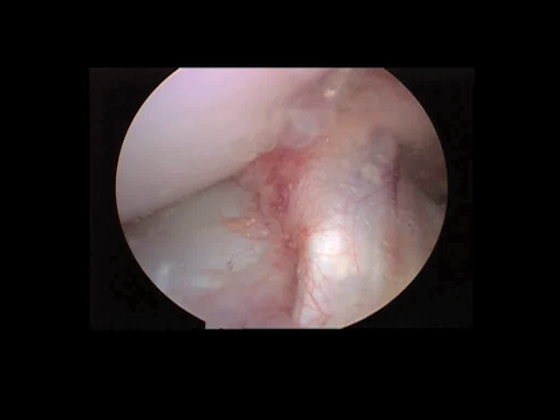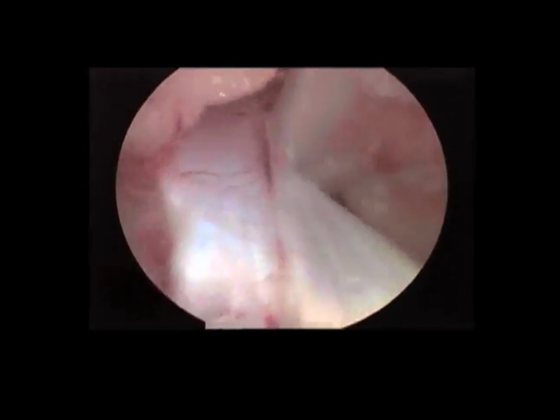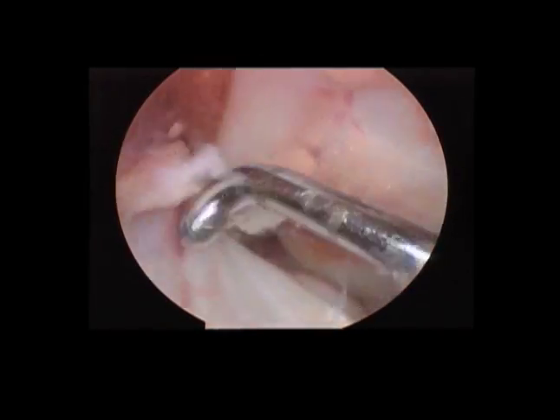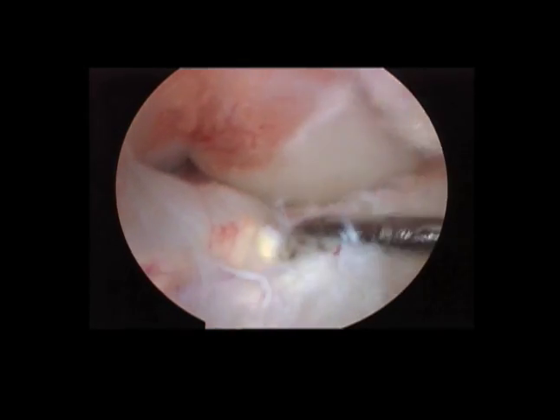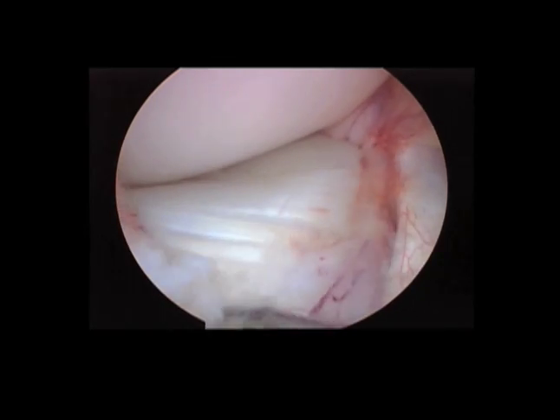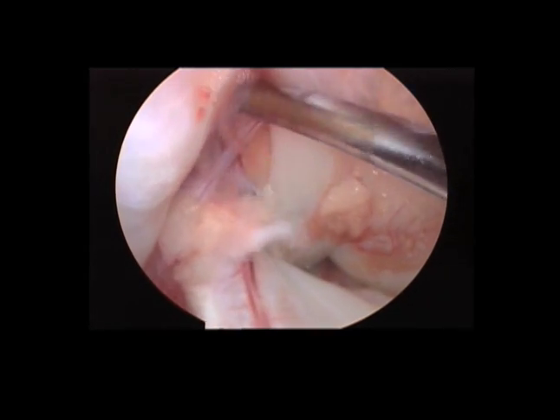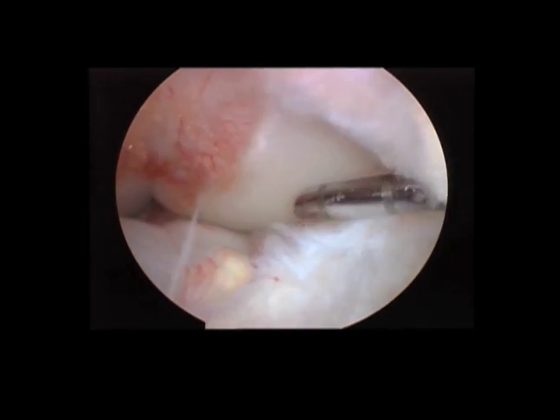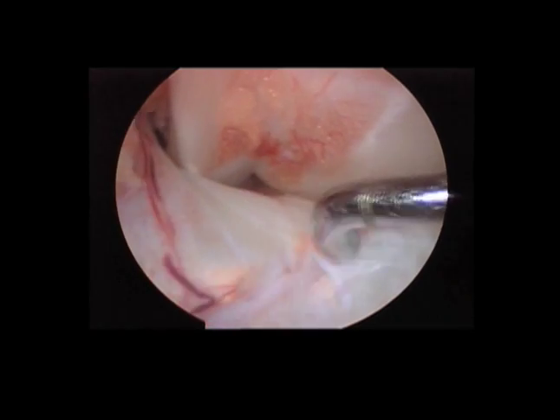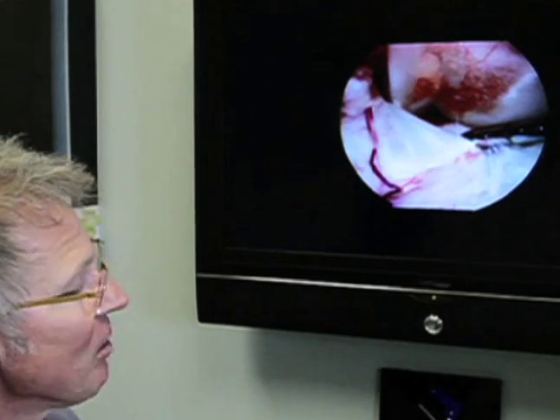The first is a normal ACL, and in this case, we're probing the normal ACL. We see nice blood vessels within it. The fibers are nice and tight, the ligament's tight. We see its base of insertion there. And then we'll look here at the posterior cruciate ligament, which almost never is involved in canine stifle disease. And again, this nice broad base of attachment of the ACL. So it's quite a large ligament. That's what an intact ligament looks like.